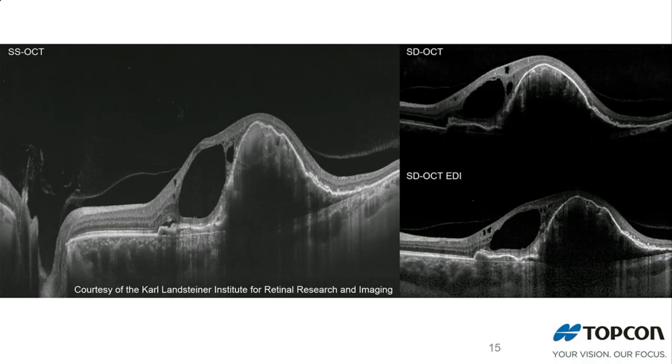Another example is this case here. So here you have a very large pigment epithelium detachment, right? And here you've got some lesions, and they're polypoidal lesions. And they're directly under the RPE. If you do spectral domain OCT, you lose all of the information here, but if you do EDI spectral domain OCT, you don't see the lesions that well. So you lose the information.